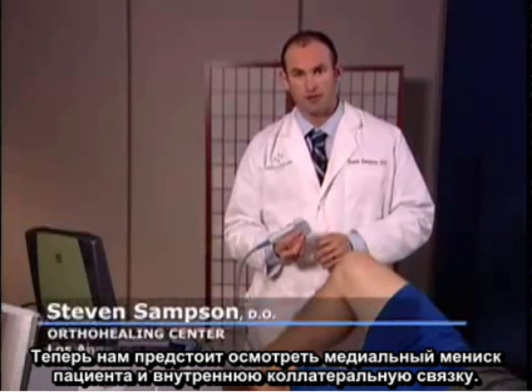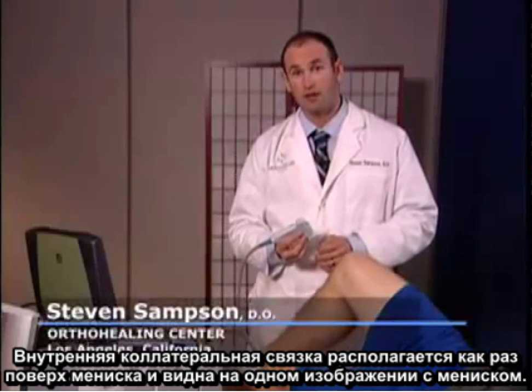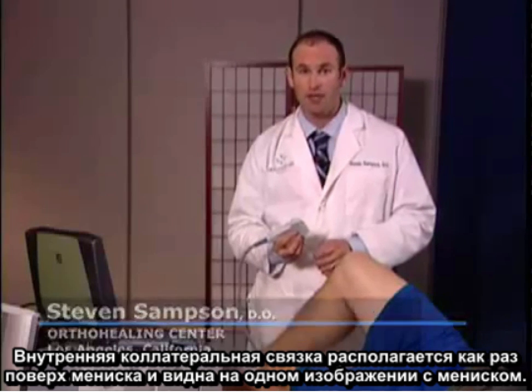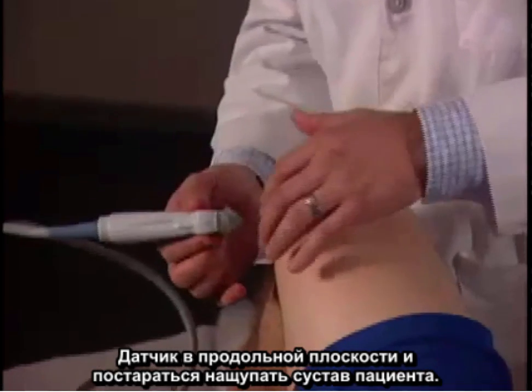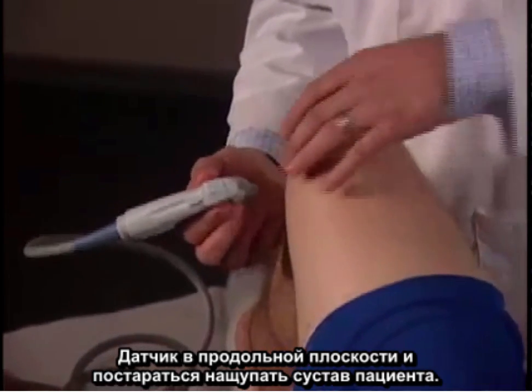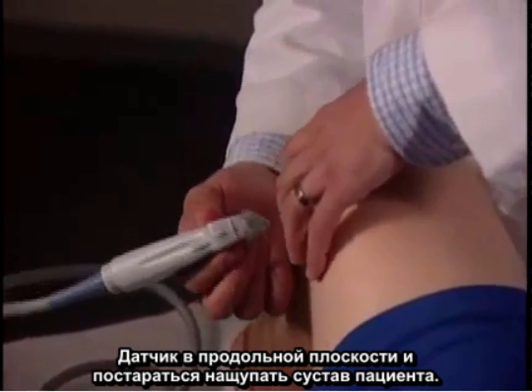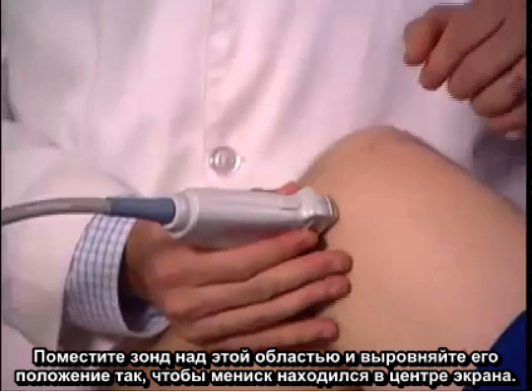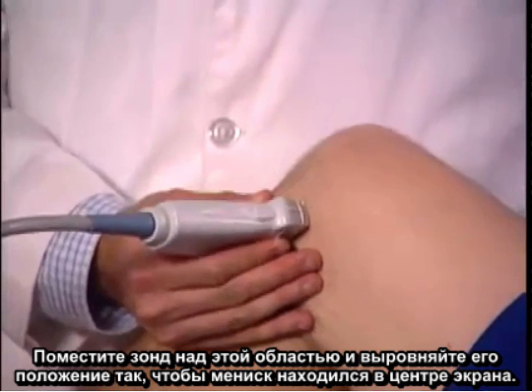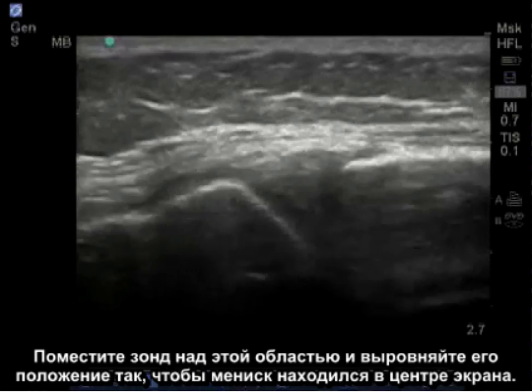Next, we're going to examine the patient's medial meniscus and medial collateral ligament. The medial collateral ligament lies just on top of the meniscus and can be seen on the same image. To identify this structure, I'm going to place my transducer in the longitudinal plane and palpate the patient's joint in the center. I'll place the probe over that area and center the meniscus on my screen for viewing.